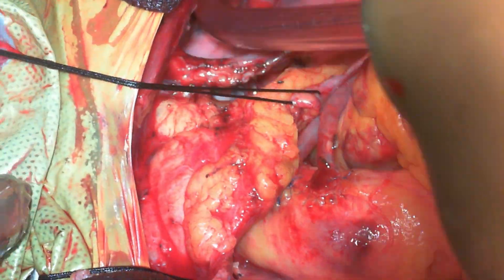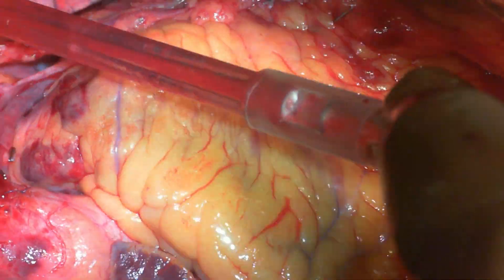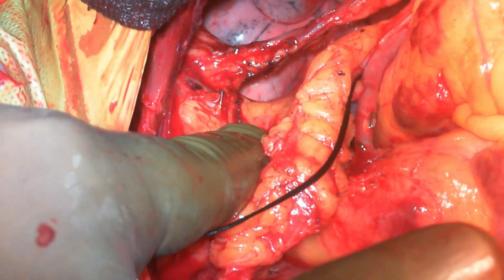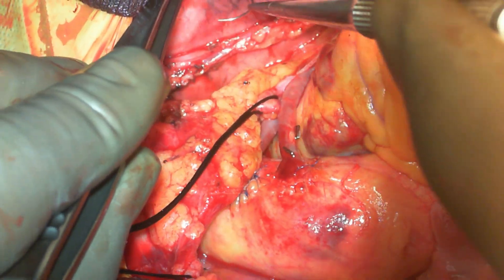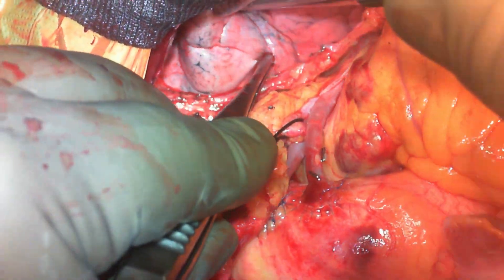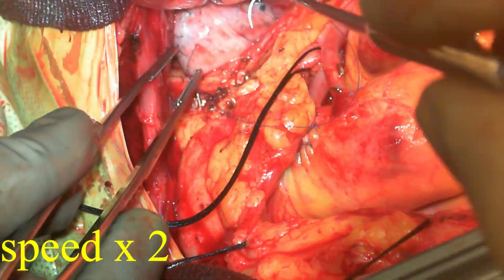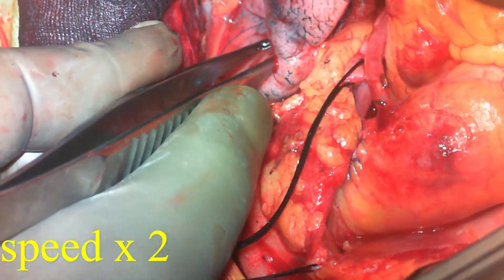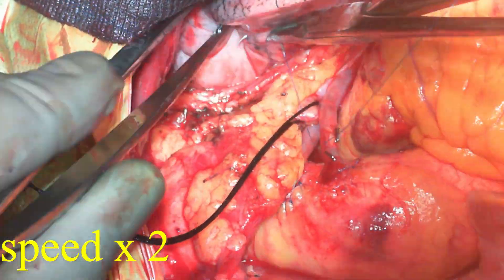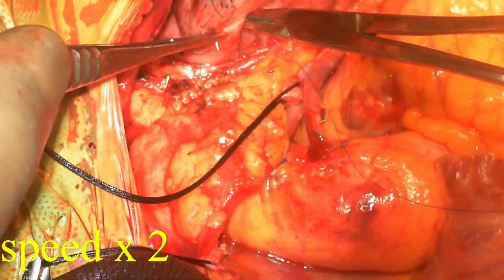This is another case — there is still about one inch of mammary artery that can be harvested at the top end. The suture is passed through the lung and then to the lateral chest wall. One can then tie it so the left upper lobe is pushed away from the mammary artery onto the chest wall.